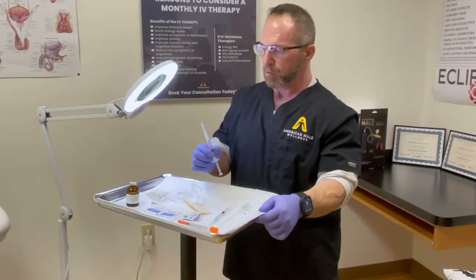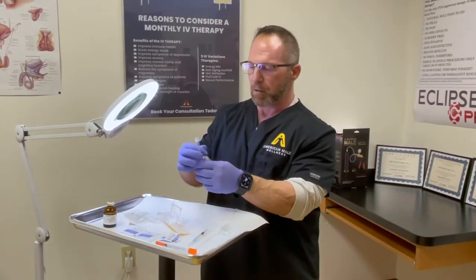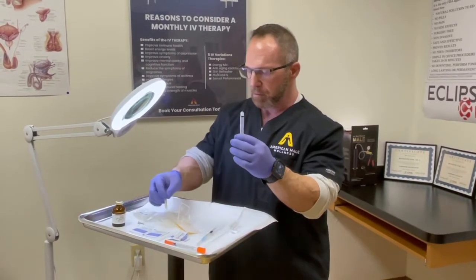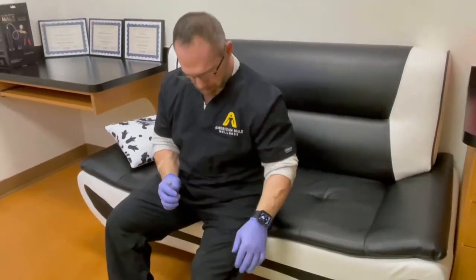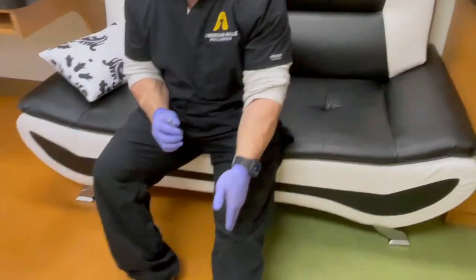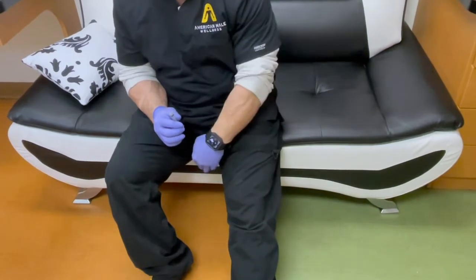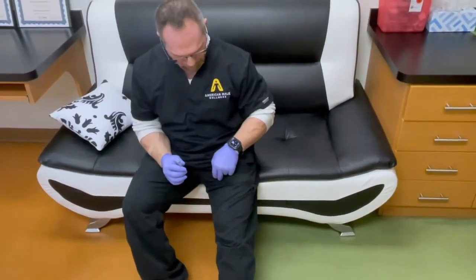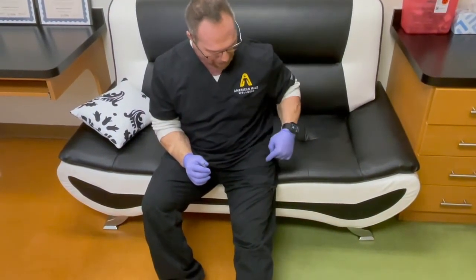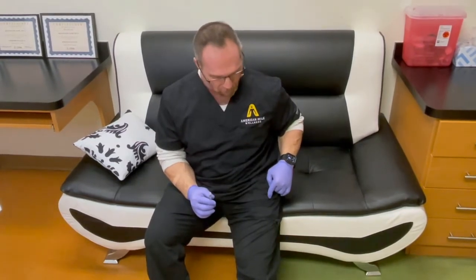Now I want to show you injection technique, starting with the quadricep — that's usually easiest for guys. Sitting down, visualize your knee and your hip. Split your leg lengthwise in half and then split it across, giving you four quadrants. You're going to inject into the upper outer quadrant of the quadricep — that's where there's the least vascularity and the fewest nerves.